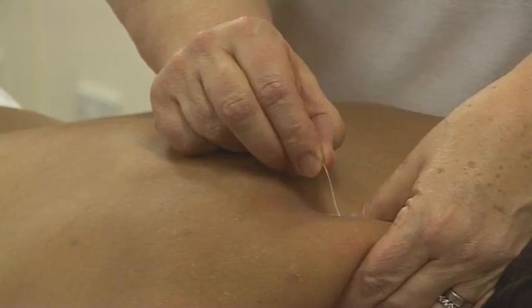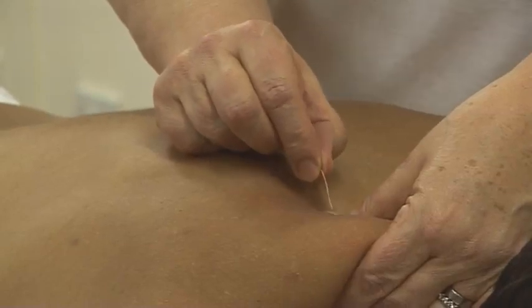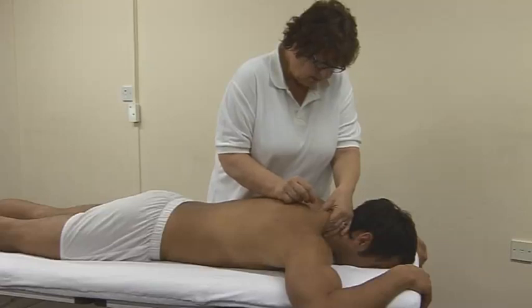The needle may initially be difficult to insert as it meets resistance from tight muscle fibres. There is big resistance here.